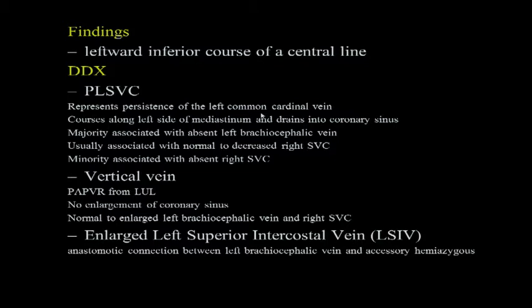Mirror image of azygos vein on the left. I couldn't hear you, but you said something to do with the azygos vein on the left? I said a mirror image of the azygos vein on the left. This is it. What did Tope say? Mirror image of azygos vein on the left. Maybe azygos fissure. Yes, so what you see is a very classic appearance. You will see a small nipple.